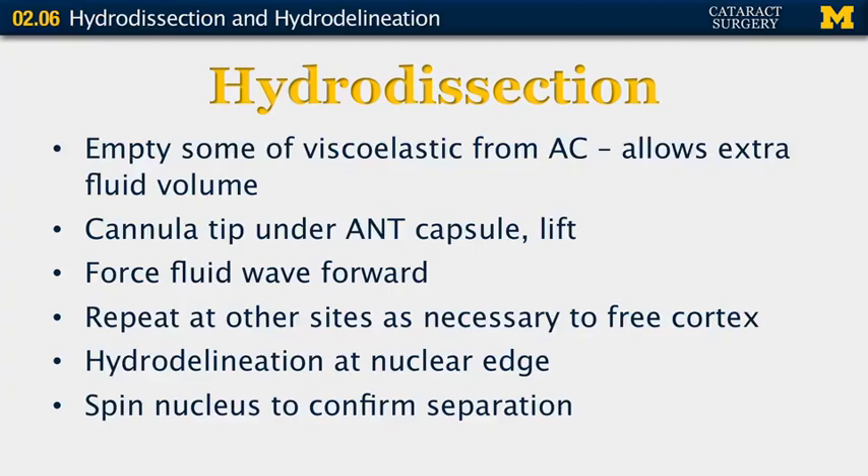A fluid wave is then forced forward, and this can be repeated at several sites as necessary to free the cortex. Hydrodelineation can then be done to show the edge of the nucleus. The nucleus is then spun to confirm that the nucleus has been separated from the cortex.